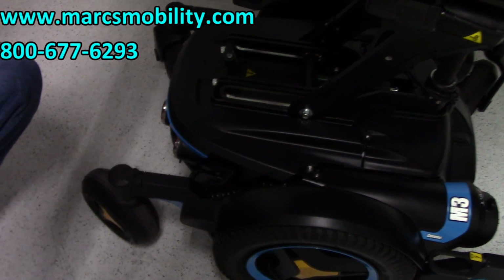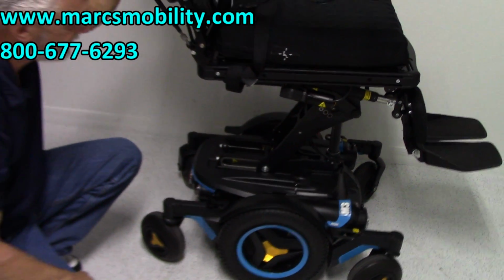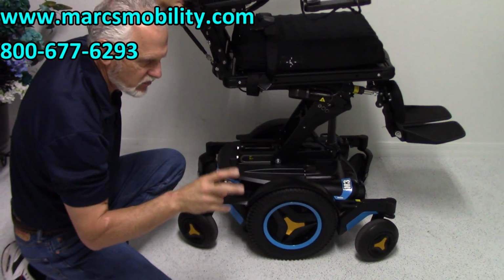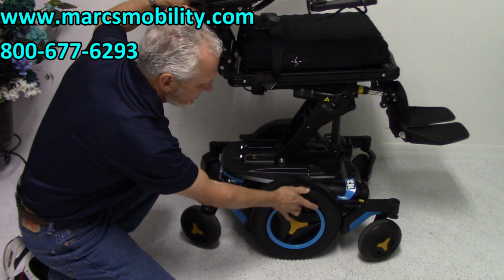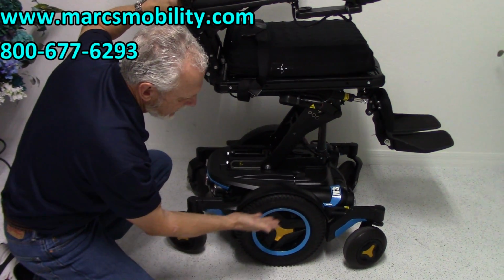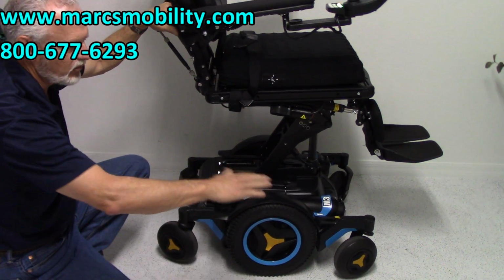You can see the suspension. If I shake the chair, you might be able to see the suspension at work a little bit. So great suspension on these Permobil, fantastic suspension. On these M3s, like all power chairs, you have 2 motors, okay? So right now, if I was to try to roll it, it's not going anywhere because it's in gear, you can hear it. It's in gear. So I would have to put the chair in neutral if I wanted to roll this chair around.